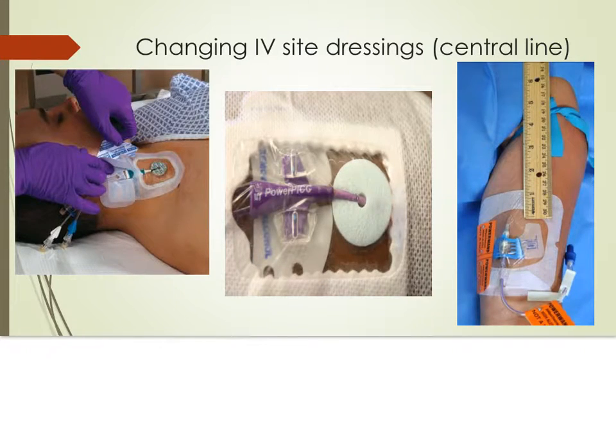Central line dressings are normally changed weekly, or if the dressing becomes soiled, contaminated, or is no longer intact. Be sure to follow your facility policy for central line dressing. Although law and rule allows a qualified LPN to change a central line dressing, some facilities still require a registered nurse to perform these dressing changes. Be careful during this procedure not to contaminate the IV site or to dislodge the catheter, especially with PICC lines.